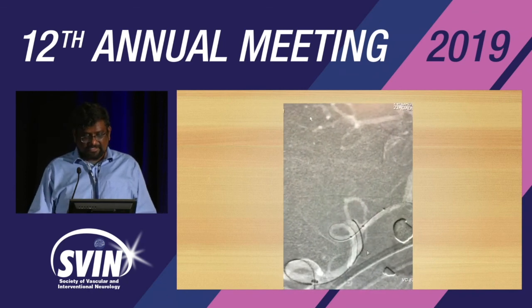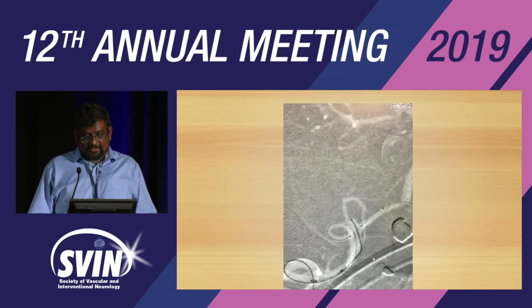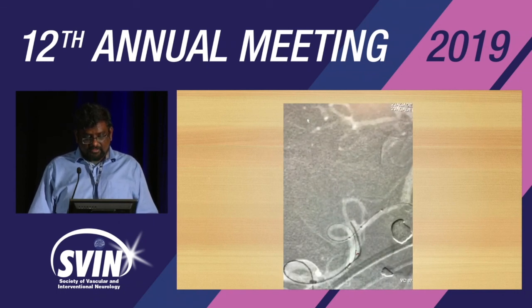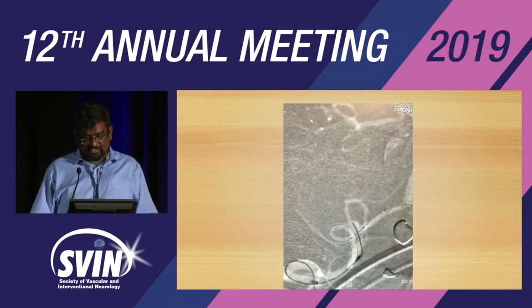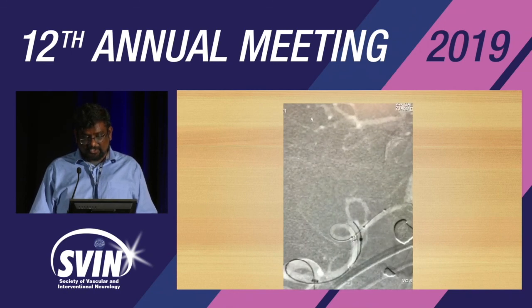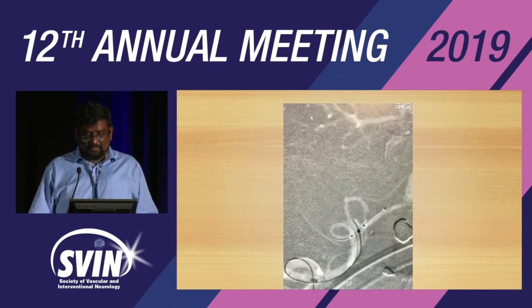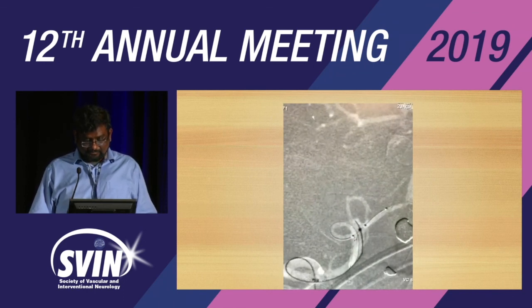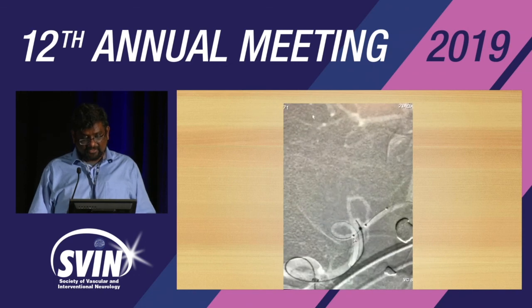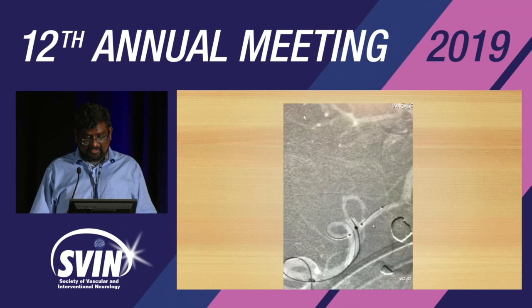Could we have clipped this? Yes, but this patient has cognitive difficulties. She already had a subarachnoid. So it's going to get hung up here at the neck. And every time I try to advance the microcatheter, it will push out. So I took the Scepter from the other vertebral artery backwards into the PICA. There's a particular reason I did it, not to look cool, but we're going to see it in a second here. We're going to inflate the balloon.